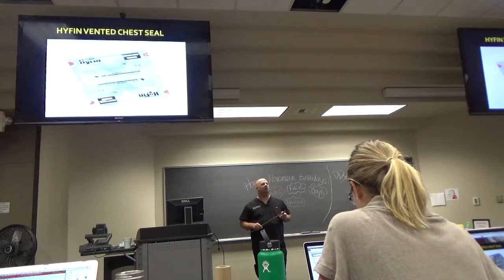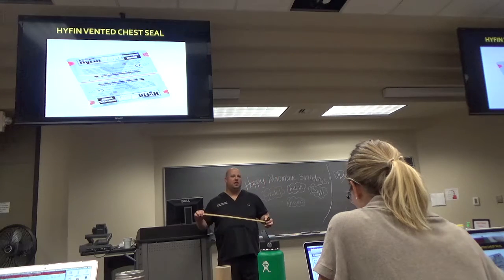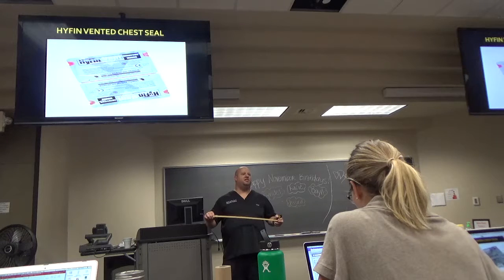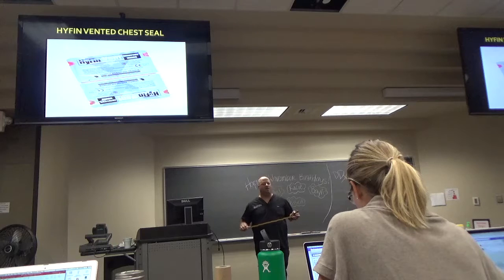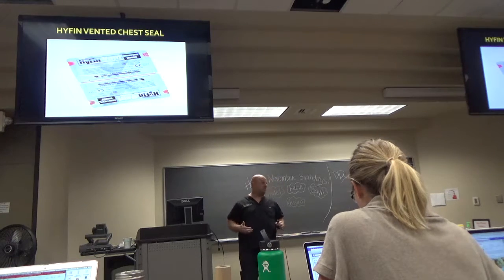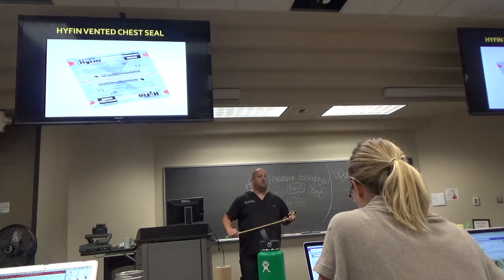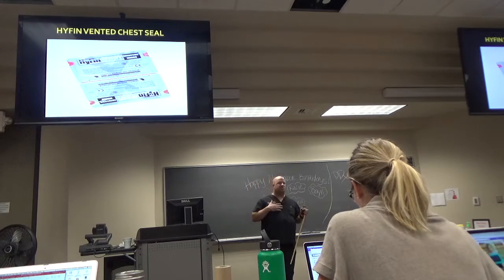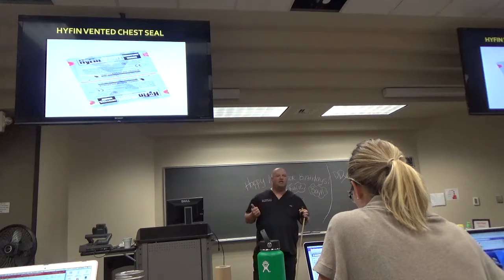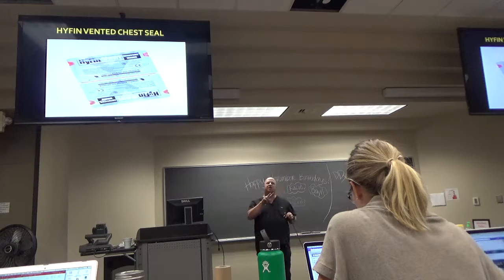The new thing with trends today is that a lot of our management of active shooters and chest trauma is really coming from the military and tactical combat casualty care. They're really setting the standard for how we take care of these trauma patients. Obviously, they're involved in dramatic events on a daily basis, overseas and in wars, so there's lots of data, lots of studies. And so with these chest seals, there's the HyFin, there's Halos, there's H&H. HyFins and Halos are probably the two most common ones that are used.